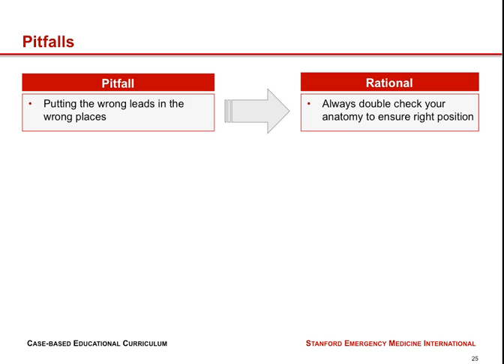Pitfalls. Let's talk about some potential pitfalls. For example, putting the wrong leads in the wrong places. This is, of course, easy to do. You prevent it, of course, with practice, reviewing this video to make sure that you position all of the leads in the correct places.